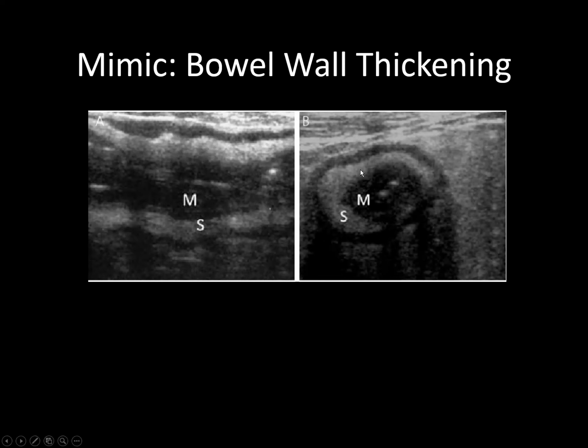If not, the appendix does not peristalse, whereas the rest of the bowel will peristalse. Even when inflamed, it could be diminished peristalsis, but hopefully you might be able to have the tech document peristalsis along this inflamed bowel and then exclude appendicitis in this case.